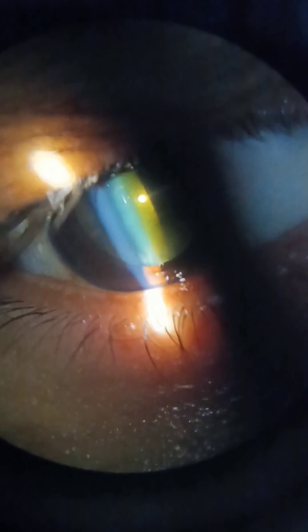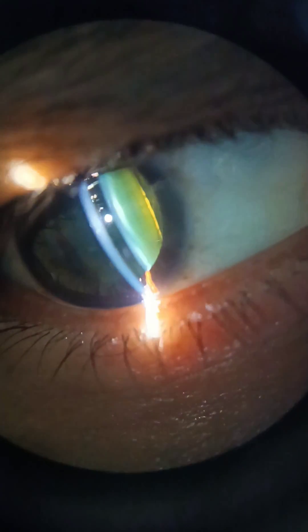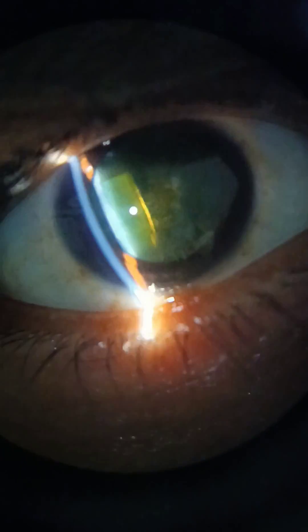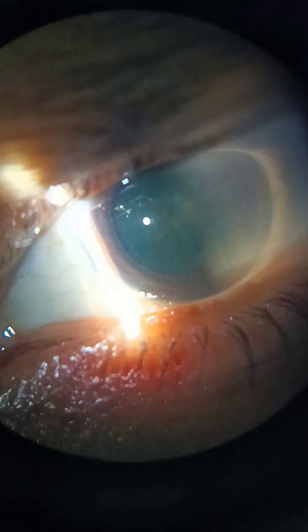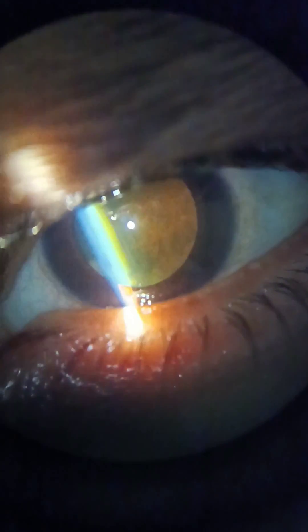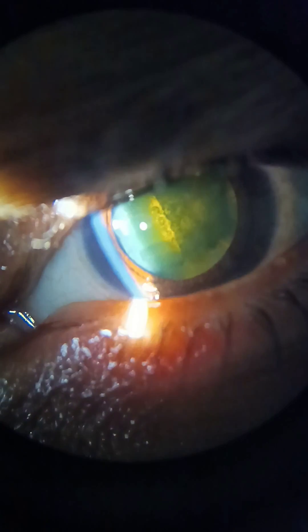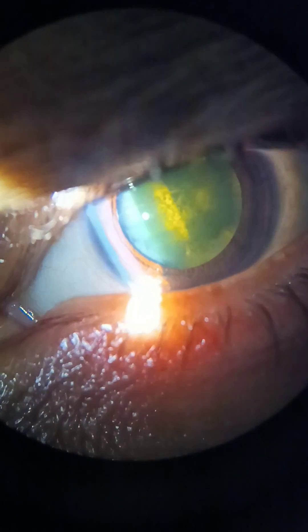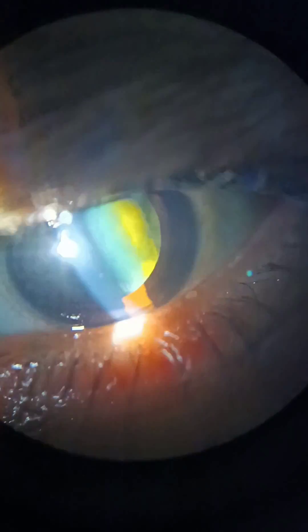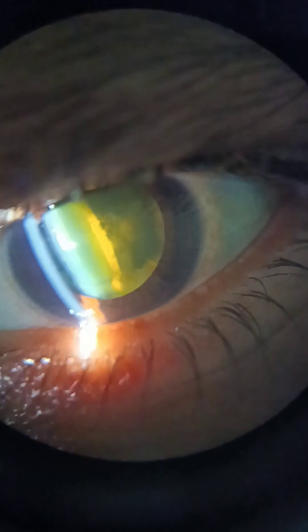On dilated pupil examination under the slit lamp, there is an opacity in the posterior polar region, which is quite obvious. When examining the optical section under the slit lamp, you can see opacity in the posterior polar region. It is quite difficult to differentiate between posterior subcapsular and posterior capsular opacity.